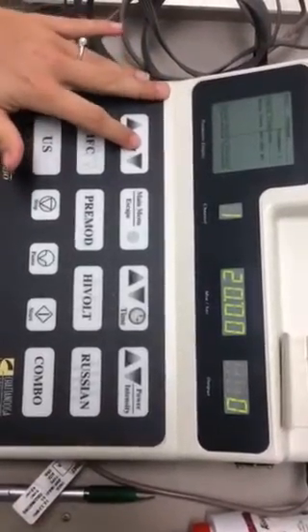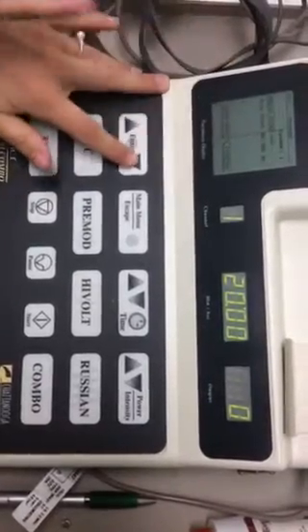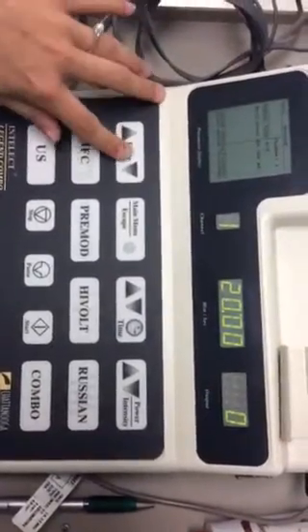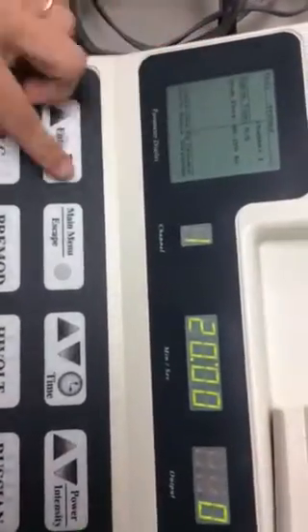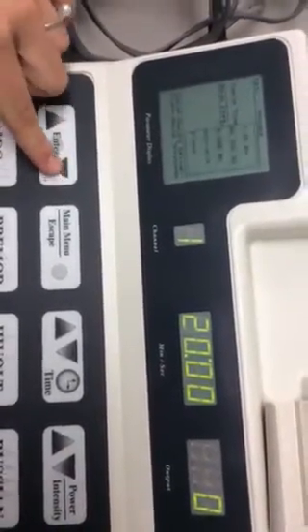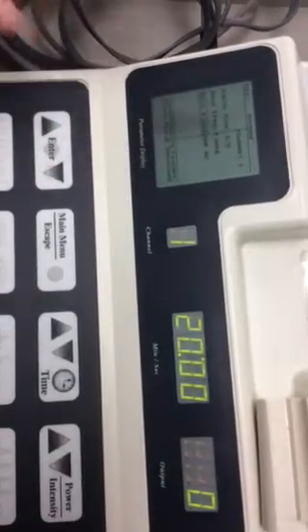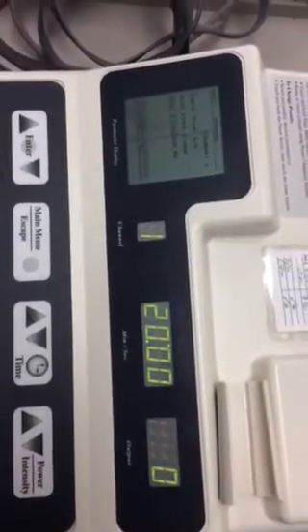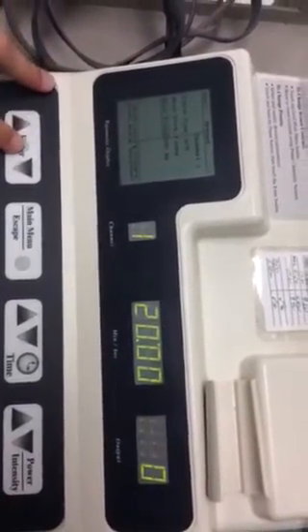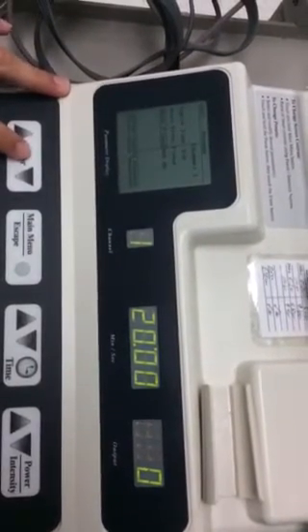So we can change this for muscle contraction. Again, you can change any of those. It looks like you only have 5 out of 5 as a choice, so 5 seconds on, 5 seconds off on this one. You can change the beat frequency. Since you want a muscle contraction, you want it fixed. And depending on what type of muscle you're using, if it is a postural muscle, you want it more around 30 hertz. If it's a fine motor, you want it more around 50 or 60.